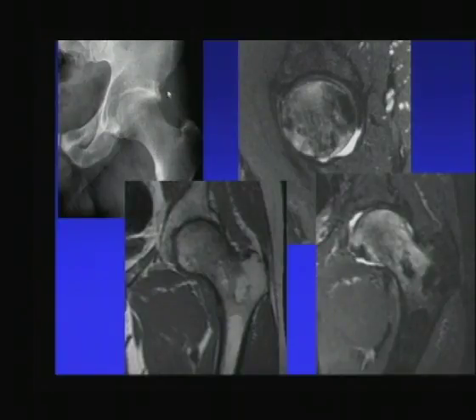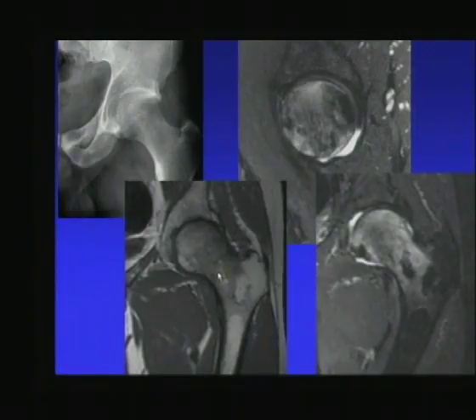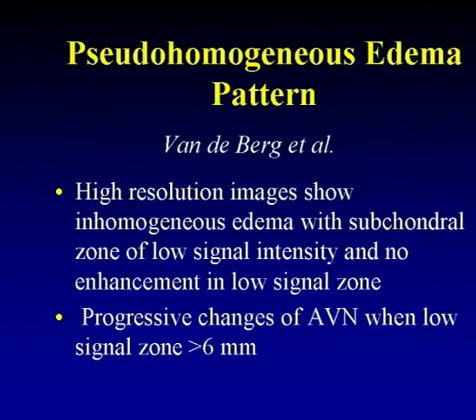Here is an example where the radiographic study done several weeks down the line shows periarticular osteoporosis. The T1-weighted image shows low signal, and the PD or T2-weighted fat-suppressed image shows bone marrow edema extending into the femoral neck. Another example is an individual who had started having hip pain in the last trimester of her pregnancy. Then after she gave birth, the left hip became symptomatic bilaterally, and we followed this lady until she had complete resolution of the bone marrow edema bilaterally.